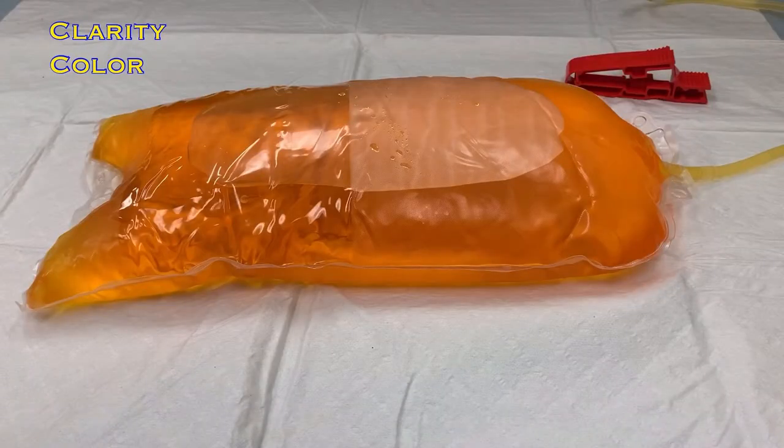Next, you'll look at the color of the fluid. And finally, you'll look for any sediment. Sediment will often appear as thin, wispy strands known as fibrin strands.